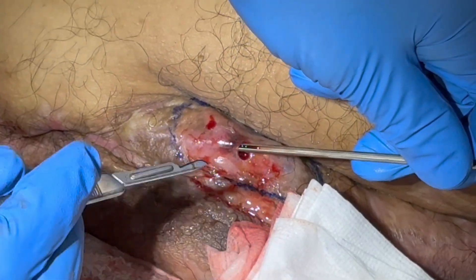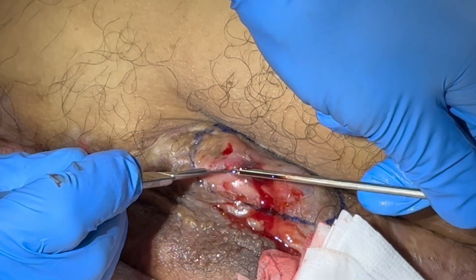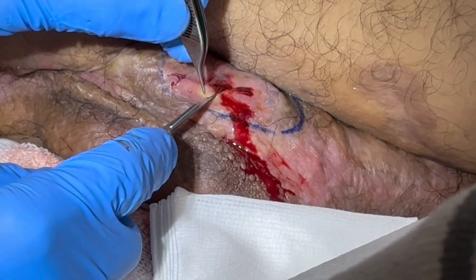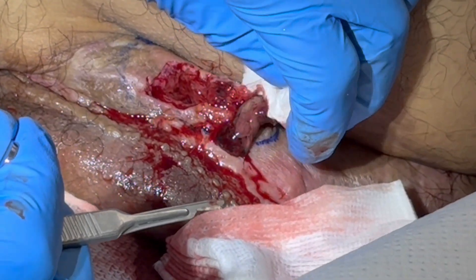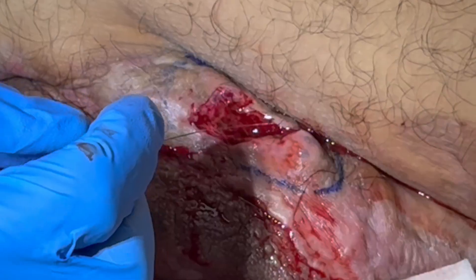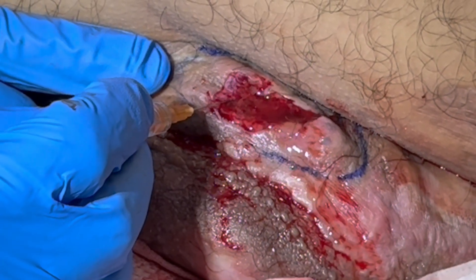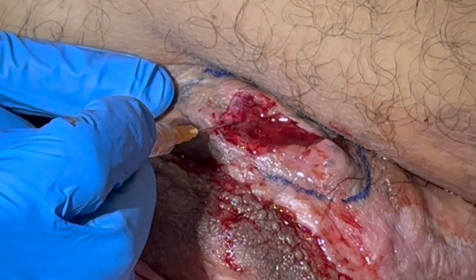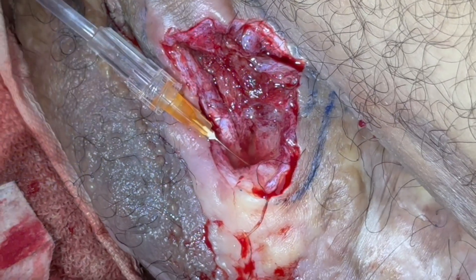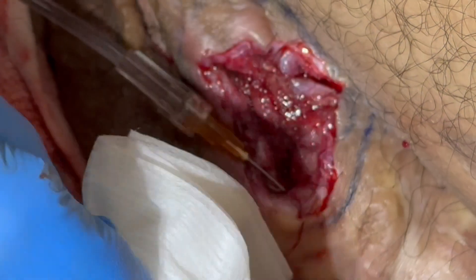Now I'm using a blade guide to help open the roof of the abscess — a painless and virtually bloodless incision. Now I can start to unroof the lesion in a painless, bloodless fashion. After opening up the lesion, I can easily express the blood clots. Now we clean up the remaining contents of the abscess. I'm adding some more local anesthesia — this is deep enough that he's feeling some discomfort; he has a very low pain threshold. So I'm getting more tumescent anesthesia before proceeding. We've finished unroofing, but there is one area with bleeding, so I simply add more tumescent anesthesia. The compression as well as the vasoconstriction allows good hemostasis.